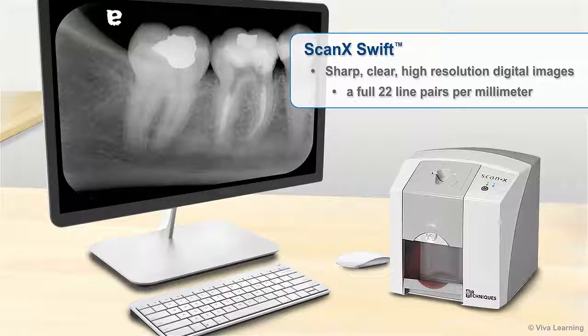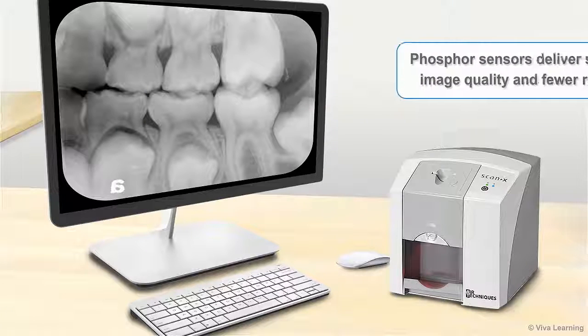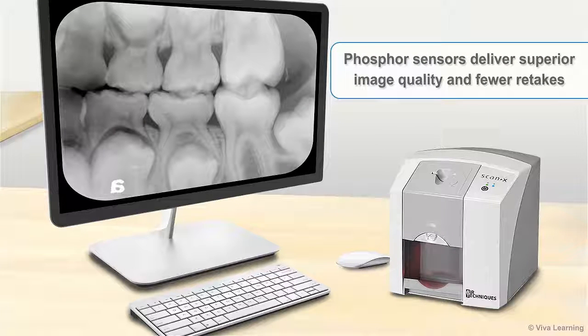You'll also appreciate ScanX Swift's sharp, clear, high-resolution digital images — a full 22 line pairs per millimeter. Research has shown that phosphor sensors deliver superior image quality and fewer retakes.